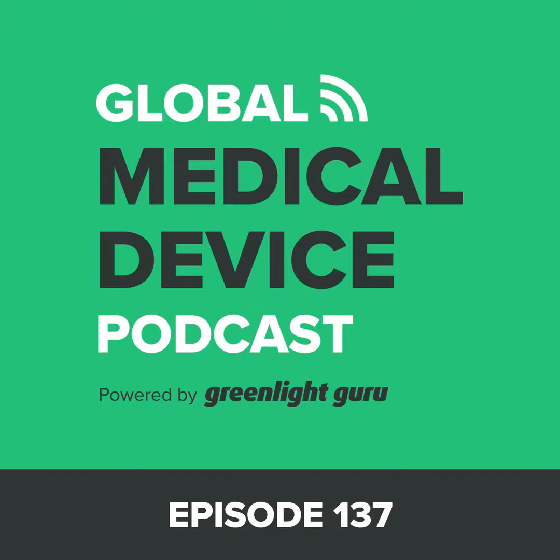I mean, you should have been doing this stuff anyway. To Cathy's point, even under the EU MDD, the Medical Device Directive, the 62304 and the MDD were very much in alignment, and I believe the same is true for 62304 and MDR. The classification certainly does have an impact on your ultimate path to market, but at the same time, there was still an expectation that you would have all the software development best practices, life cycle, and all the documentation, as well as a technical file, regardless of class.